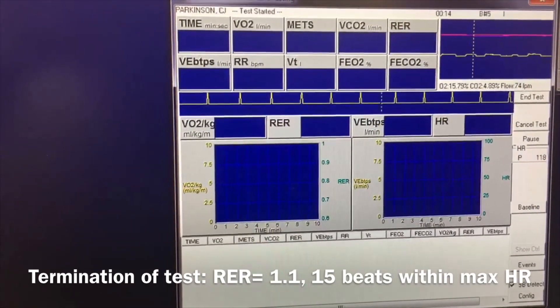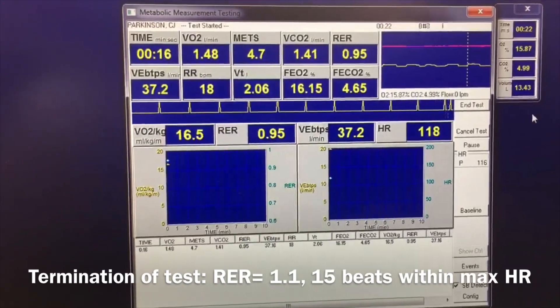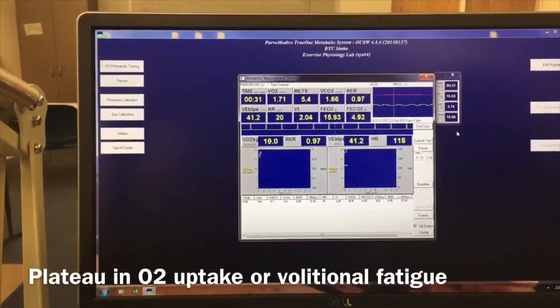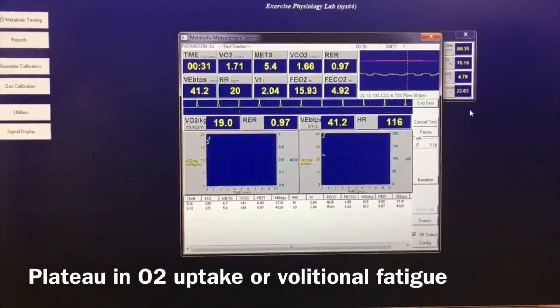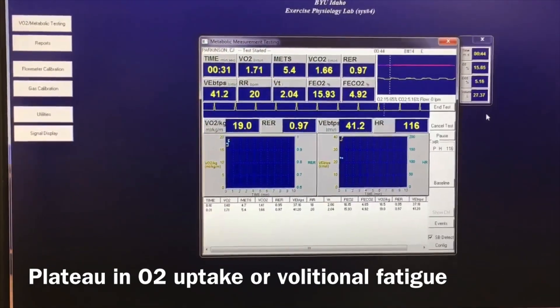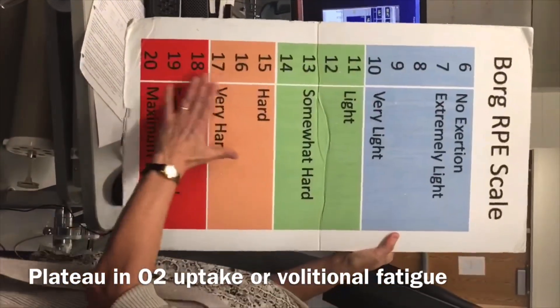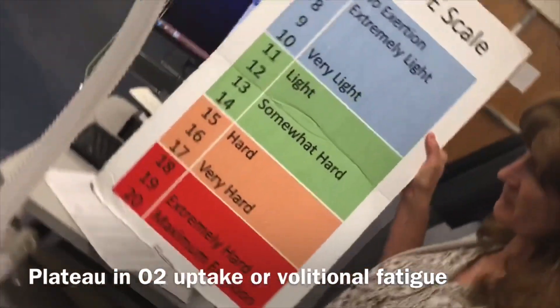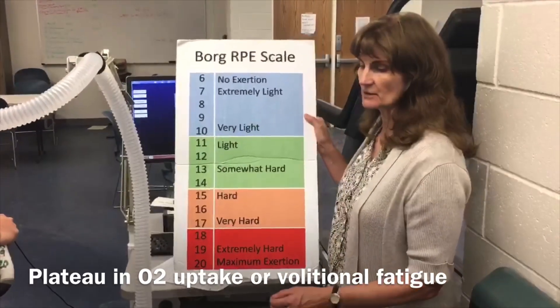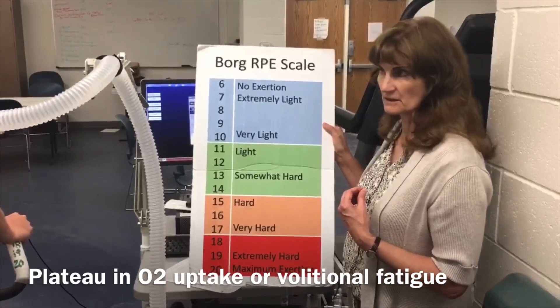We're going to record max heart rate and get within about 15 beats of that, making sure we don't go over their max heart rate. We're also looking to see if oxygen uptake plateaus. Volitional exhaustion is really what we tell our subject. We want to get an RPE — ratings of perceived exertion — in the red zone. At a 20, they're maximally exerted and done. The RPE includes leg muscles, how they feel, if they're lightheaded or out of breath — it's an overall rating.